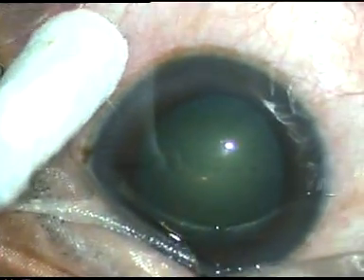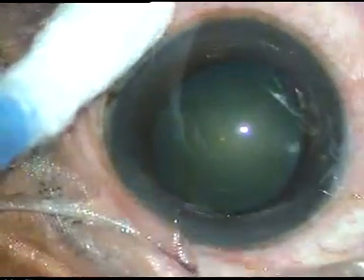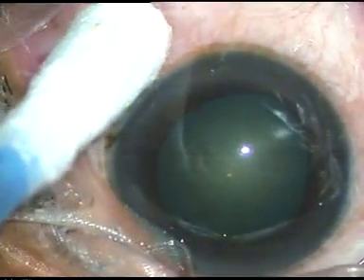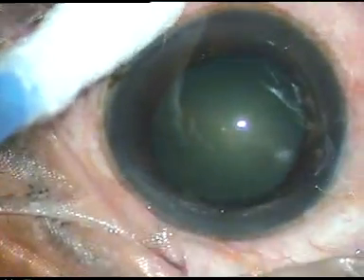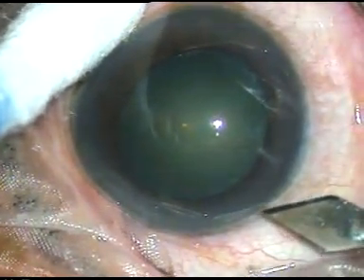Dear colleagues, this is how I fix the eyeball just with the help of a cotton-tipped instrument. The eyeball is so nicely fixed, and now this is the main incision — a 2.8mm incision.